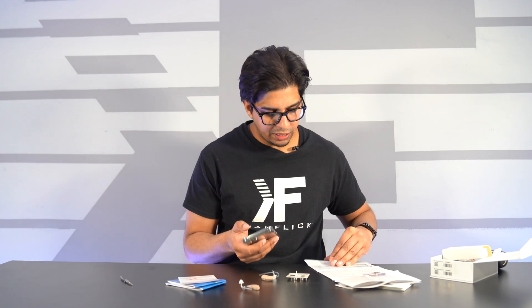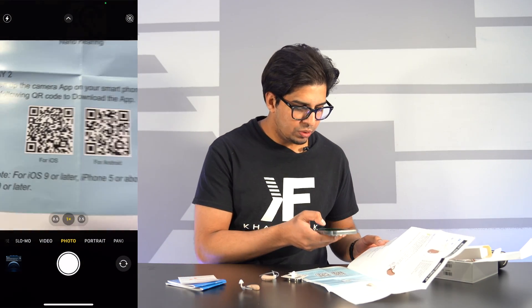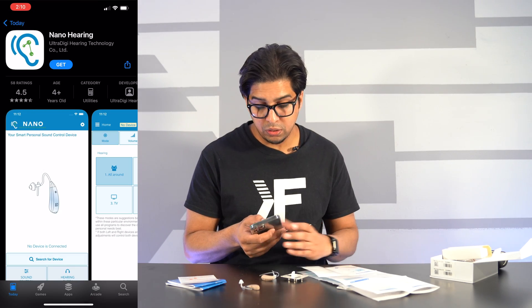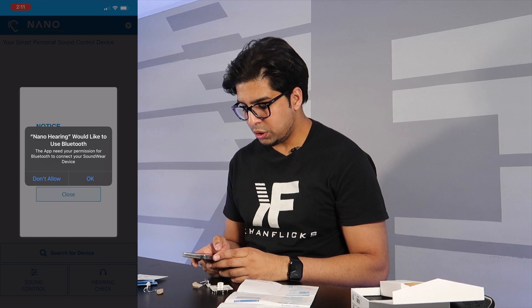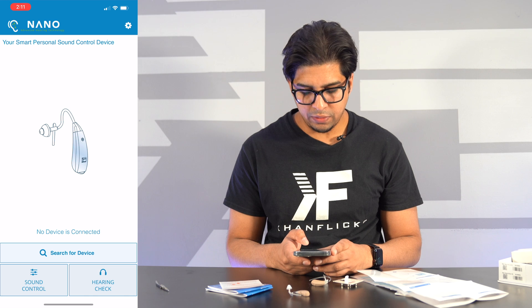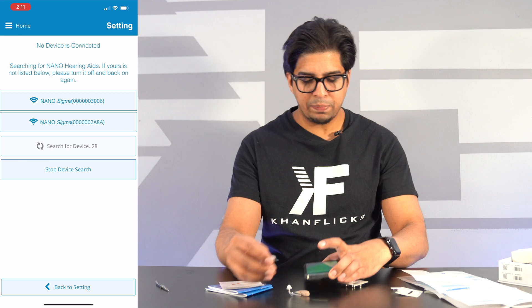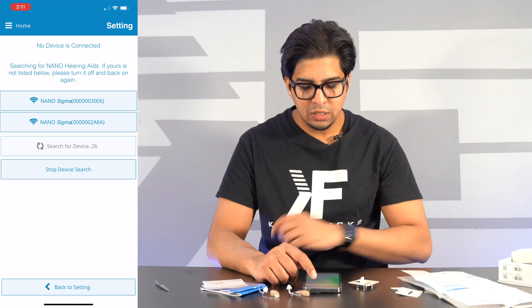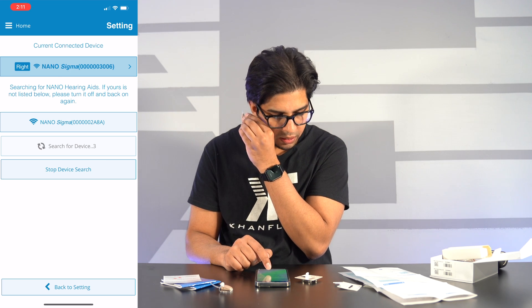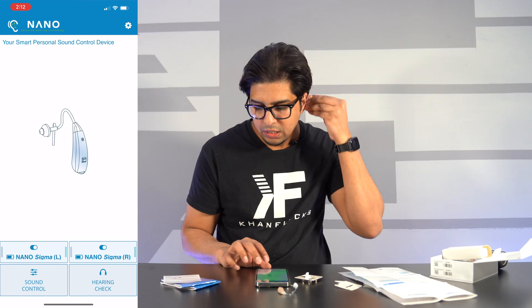We're going to click on the camera to scan that QR code. You can use iOS for Apple or the other one for Android. Click 'Get,' and it asks if you'd like to connect via Bluetooth — click OK. From there, click 'Search for Device' and 'Start Search.' It picked up on both of the Nano Sigmas, so I'll connect device to one. This one here will be our left ear — connecting to it now.